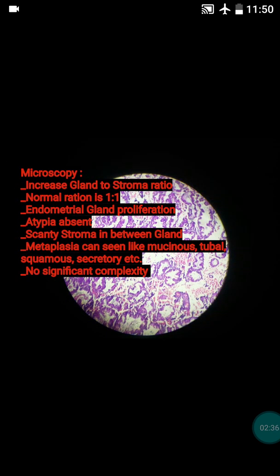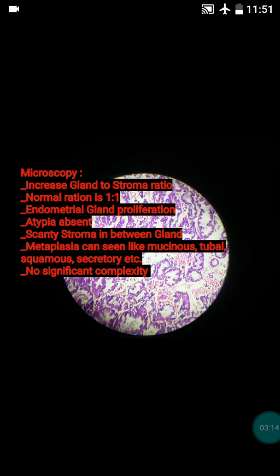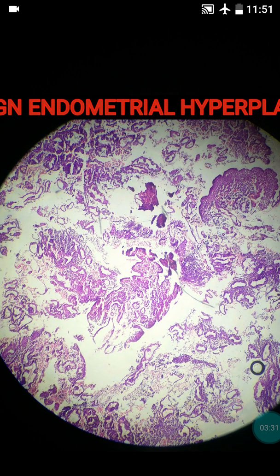Now we discuss how to diagnose endometrial hyperplasia histopathologically. The clinical presentation is usually excessive bleeding. We received dilatation and curettage material from a 27-year-old female patient. On microscopic analysis, the diagnosis was endometrial hyperplasia. The key features: gland to stroma ratio is increased beyond 1:1, meaning glands are more than stroma. In benign endometrial hyperplasia, atypia is typically absent, and there is scanty stroma between the glands.